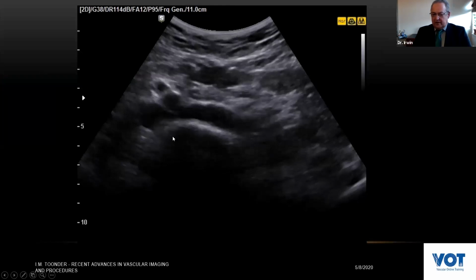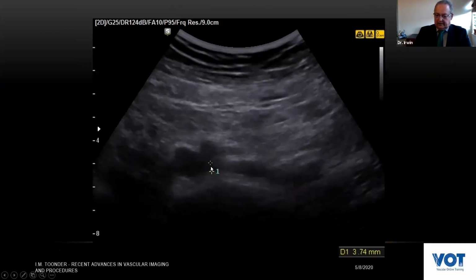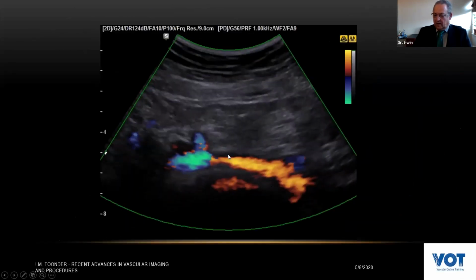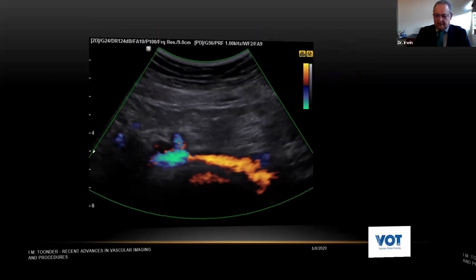Of course, if you have a patient in a supine position giving you these kinds of distances, and it looks normal, similar to the image that I've just shown you, and then you put the patient upright and the distance doesn't increase, then there must be something wrong. That means that this flexibility is gone. Then you can use color, and lo and behold, you have wall thickening. And this is what we should be looking at. We should be far more critical in our ultrasound examination and scrutiny, and assess more carefully and really play with the ultrasound settings to get a more accurate diagnosis.